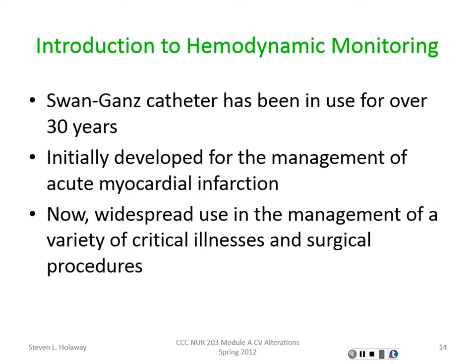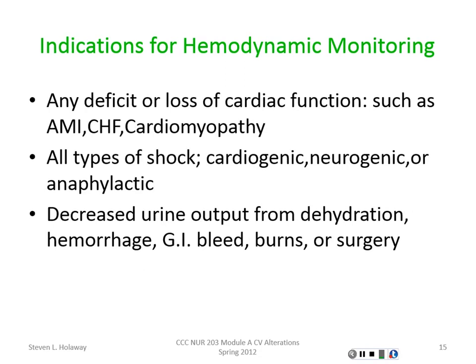Now you see it more in CVICU, and you'll see it in patients that we really need. You might see it in STICU, where we've got to manage a lot of drugs, and you may see it in patients who are in sepsis. But that's typically the only place you're going to see these. Because what we found out is that the risk of using these does not outweigh the benefits. And through good assessment of that patient, we can get the data we need without using these.